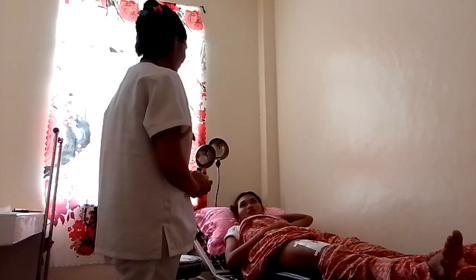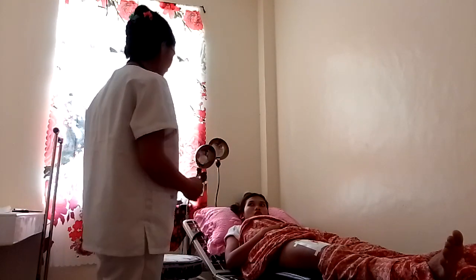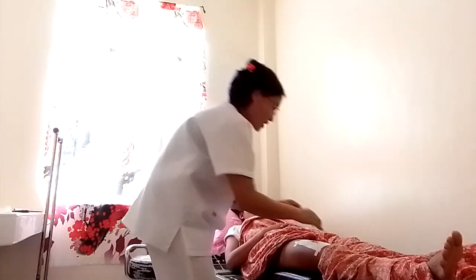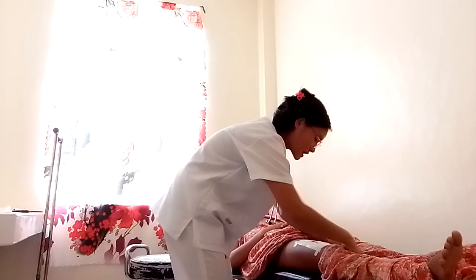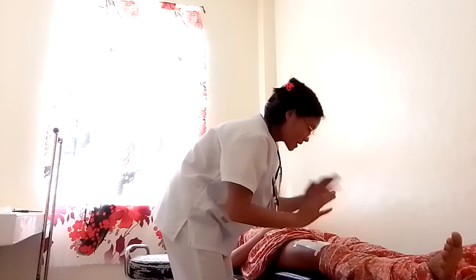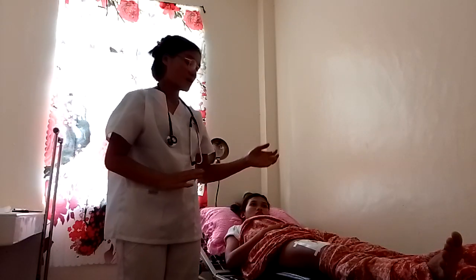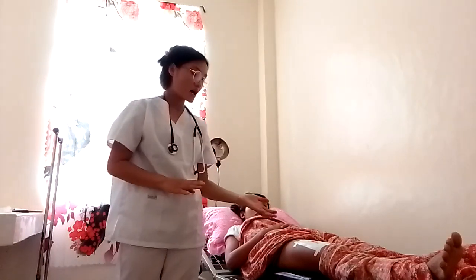Okay na ka diya sa iyong position, ma'am? Okay na, ma'am. Or atong ipa-adjustan gamay ang ato ang table or ato ang bed. Ato lang i-drape nga ang samad lang ang atong makita para padayon na ang pagbuhat sa ato ang wound care. Since okay na itong client, comfortable na siya, then na-drape na nato siya, we need to proceed to the next step.